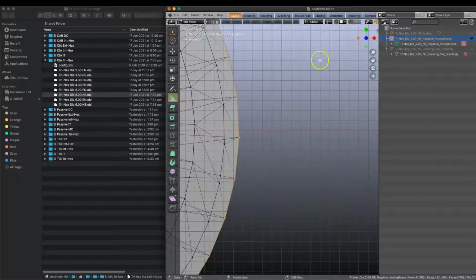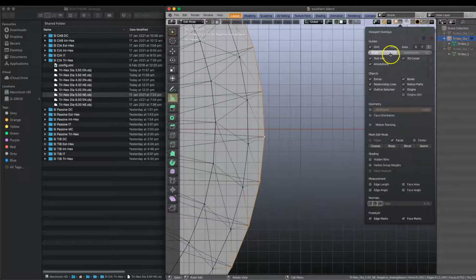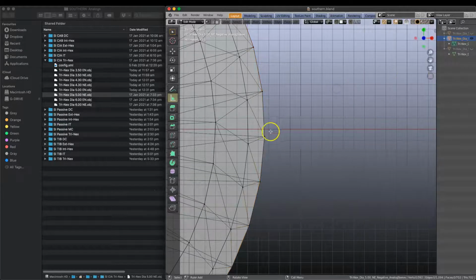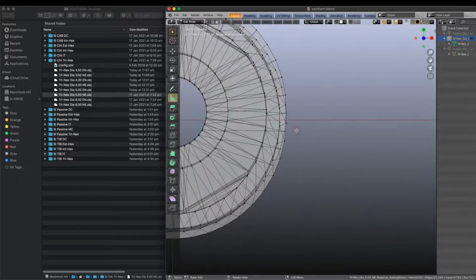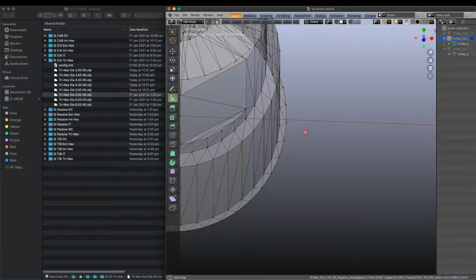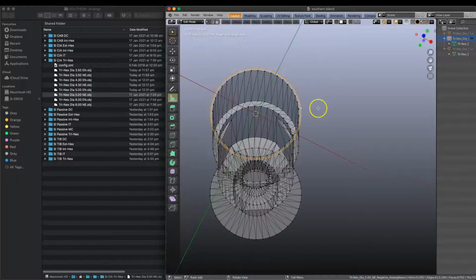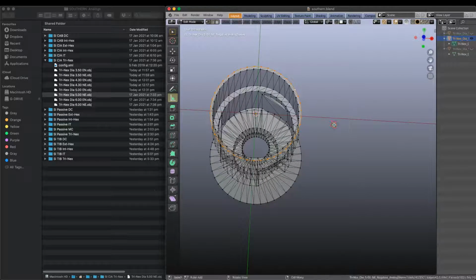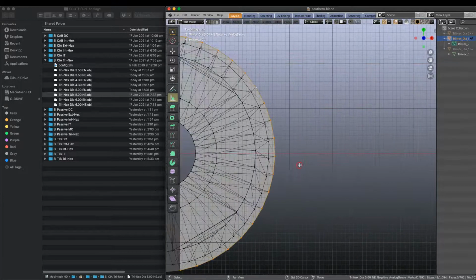Now, if your grid isn't set to 0.1, you can do that here. So here, by default, it is set to 1 millimeter. So we want to work in greater detail. I've reset that to 0.1. So do the same. Each square would measure the 0.1. Again, select the edge loop because I have accidentally deselected it. Alt left click. That's good practice, so you get the hang of it. Tilde key, view it from the top. Alright, we're going to zoom in.